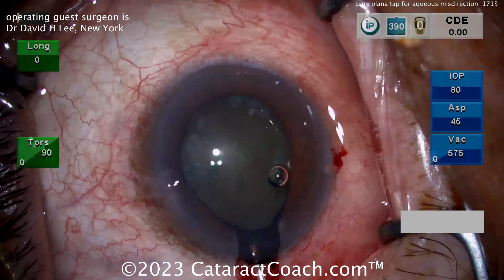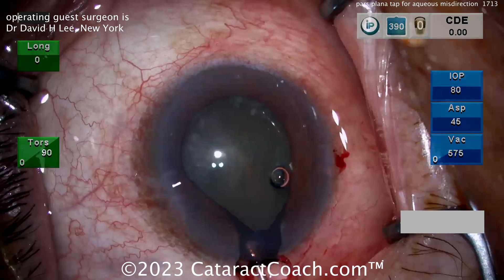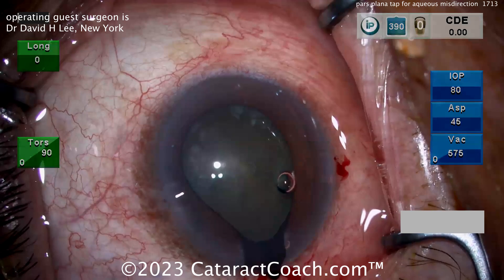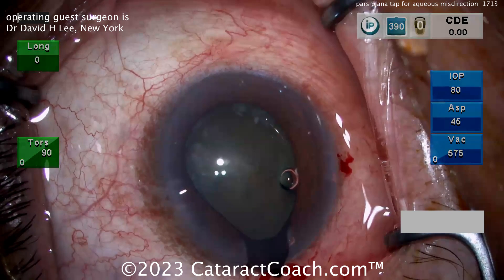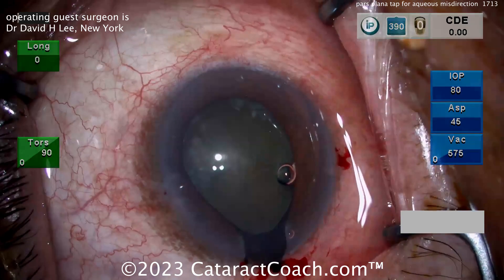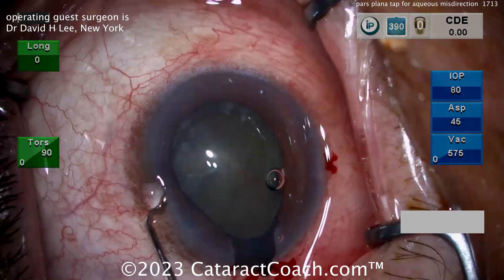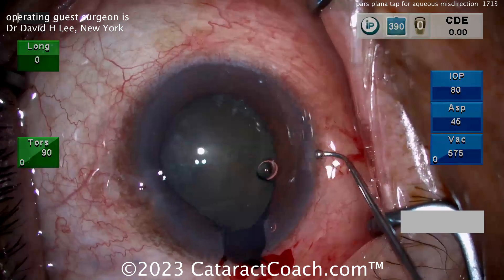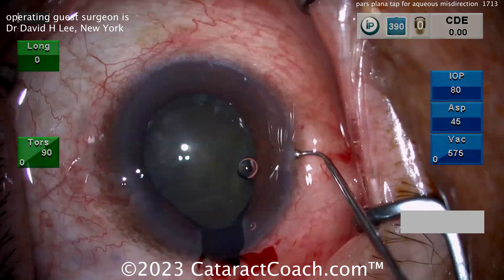But in this case, the surgeon is suspecting that there's some zonular weakness or a gap in the zonular support, which has allowed the BSS that went into the eye to go around that gap and into Berger's space and behind the posterior capsule, basically collecting fluid in the anterior hyaloid space.